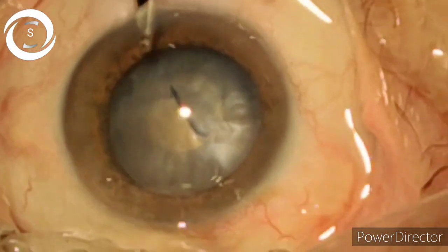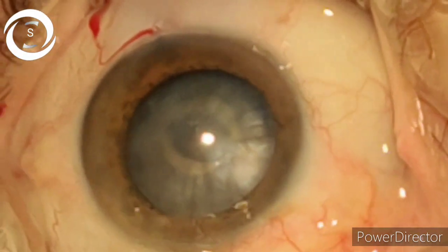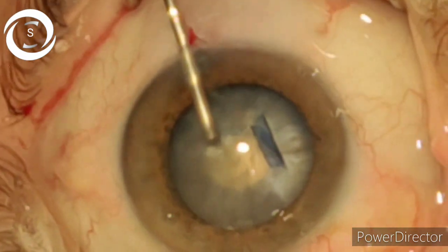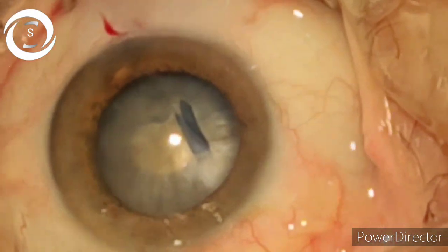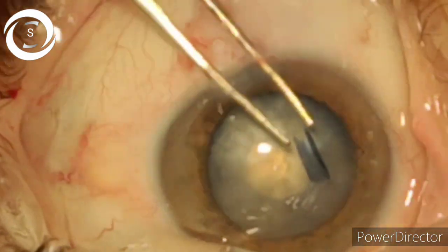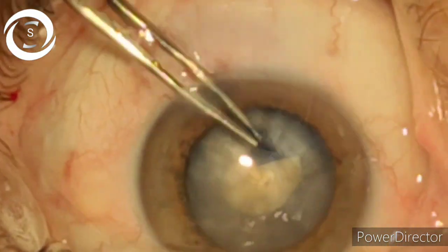This will make sure that the chances of the rhexis going radial are decreased. Now again put viscoelastic, take the Utrata forceps, and bring the rhexis centripetally and circularly, slowly and gradually. I am now slowly and gradually increasing the circle.